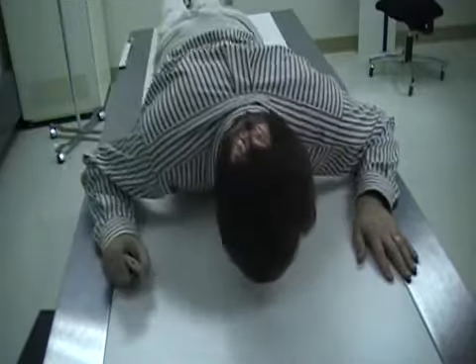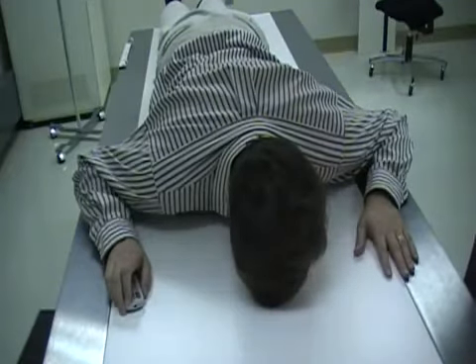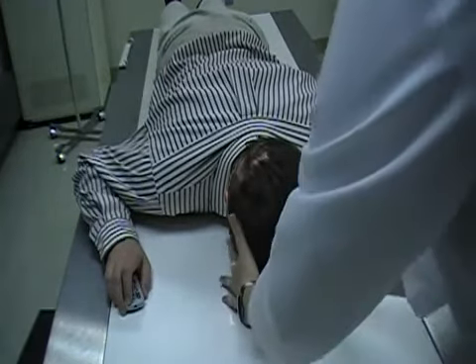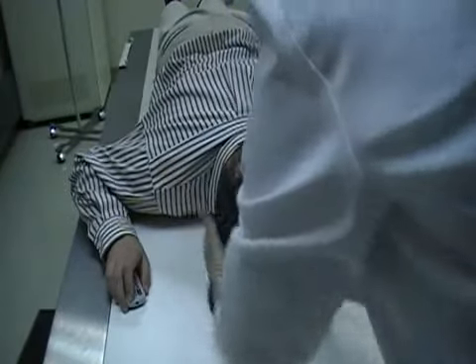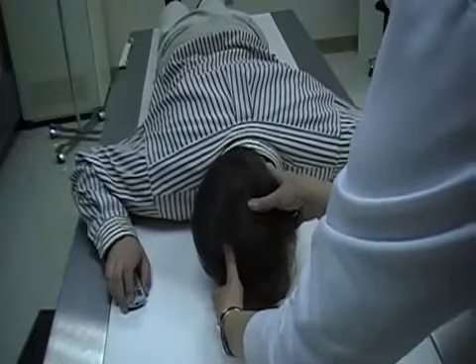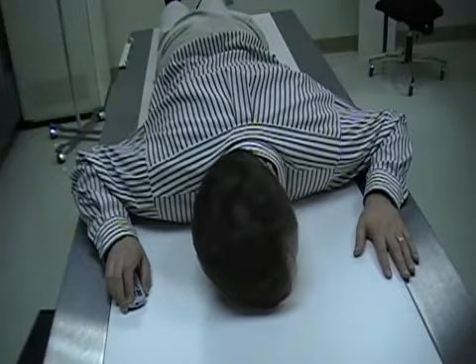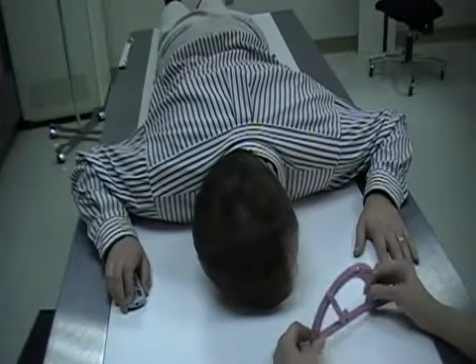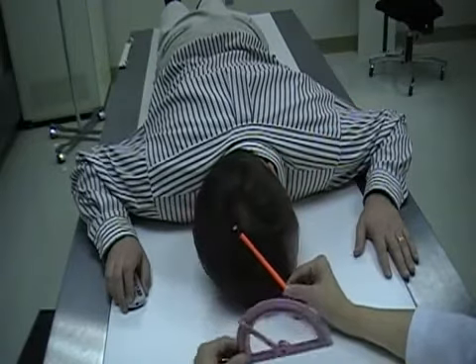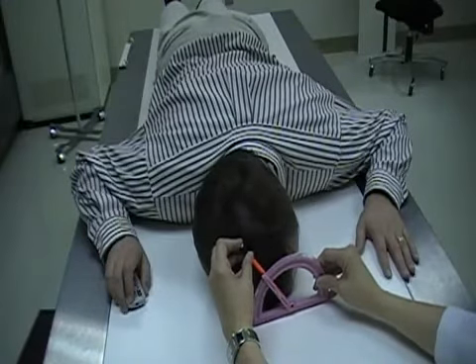Next we're going to do the Stenvers position. With the Stenvers you're going to have a 12-degree cephalic angle. Check the head and make sure it's nice and straight. We're going to actually turn the head 45 degrees, so that's about halfway. If you're not sure about your angles, you can get a protractor and set it for 45 degrees. You can mark your mid-sagittal with a pencil and then hold it into place and put your protractor right up against it.